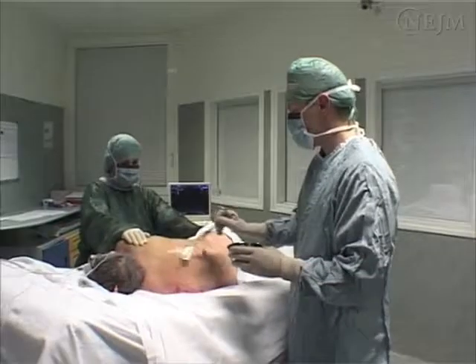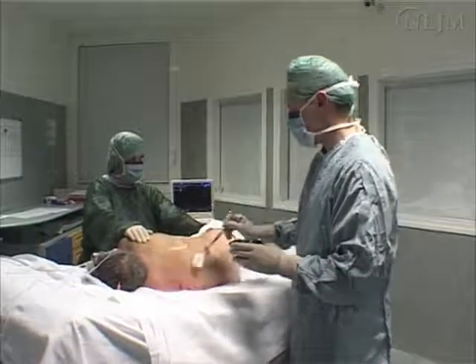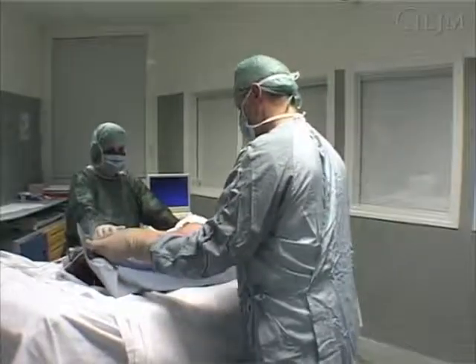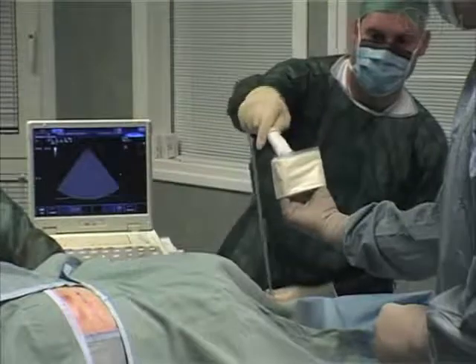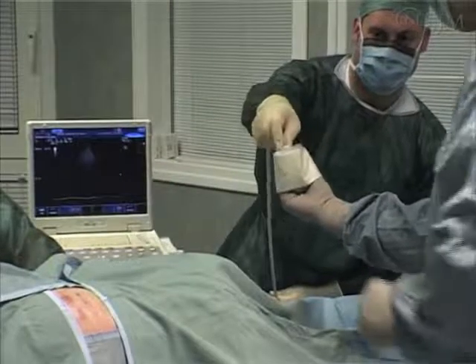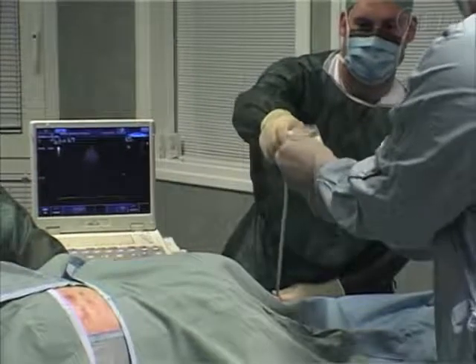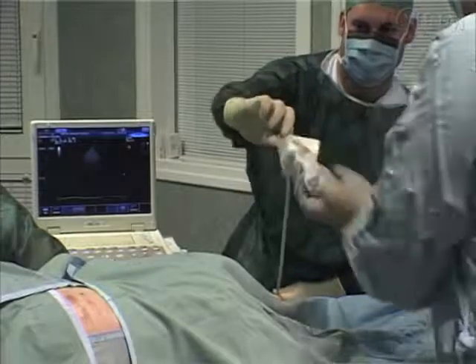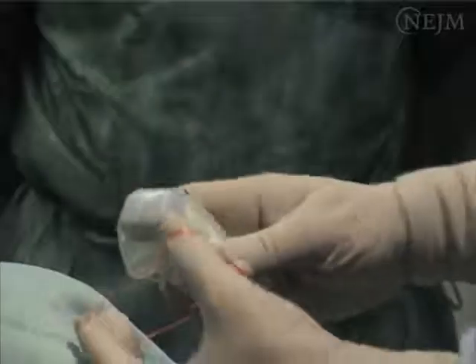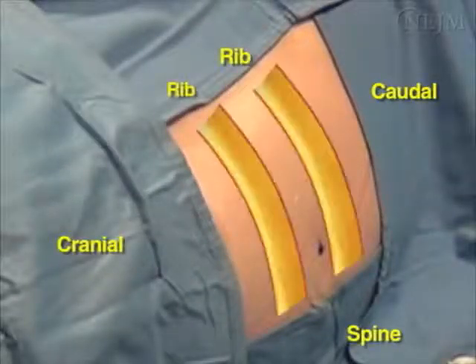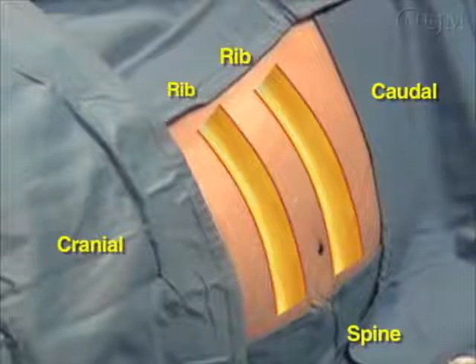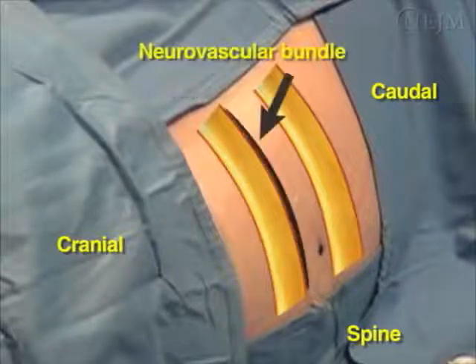Using gauze soaked in a sterile disinfectant preparation, thoroughly disinfect the skin and place the sterile drapes around the selected site. Prepare the probe: with the help of a second operator, apply ultrasound gel to the probe and cover it with a sterile sleeve, then secure the sleeve to the probe. The needle must be inserted in the intercostal space on the top of the inferior rib in order to avoid the neurovascular bundle, which lies beneath the lower edge of the rib.